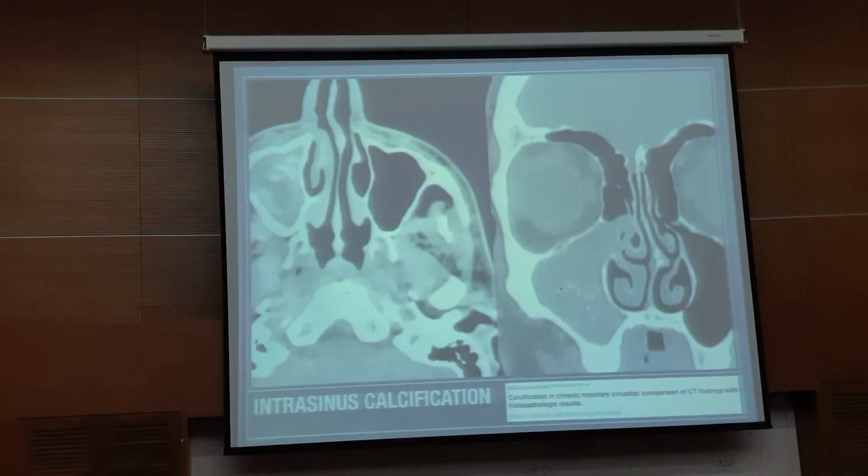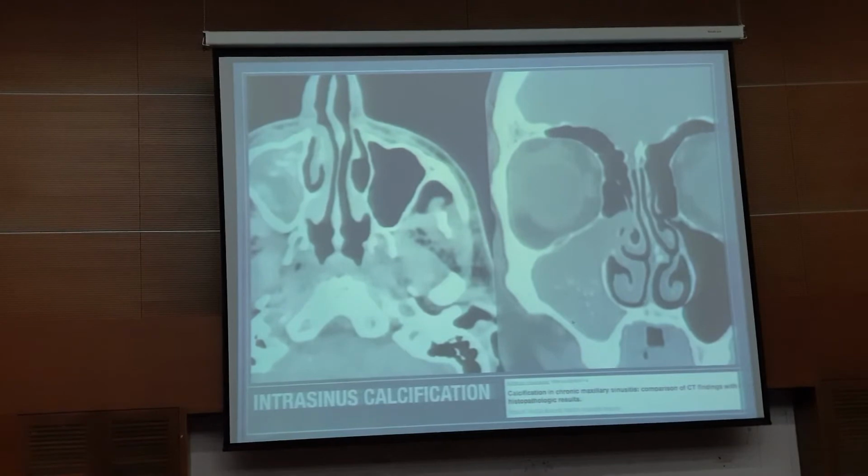Mainly, if it's central and very small and punctate, the articles do say that tends to favor fungal, whereas more peripheral and coarse-looking calcification is often non-fungal. But it is not a hard science. So just something that we may or may not see.